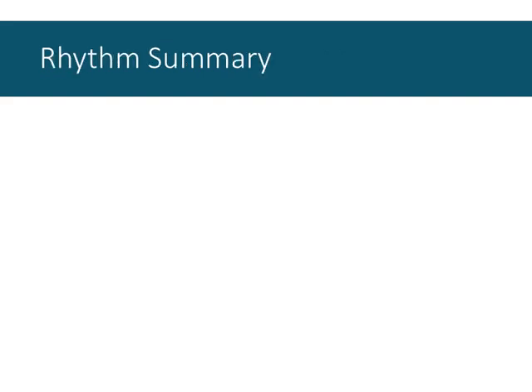So let's talk about rhythm. And this is my synopsis, my summary of some of the steps to take in trying to diagnose rhythm, because it's one of the spots where you need to have some insight and creativity, and there's not a clear pathway like there is for rate. 300, 150, 100, 75, 60, 50, like that is fixed. We know how to diagnose or estimate rate.